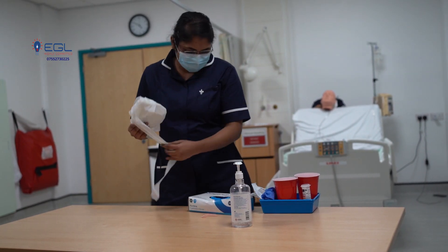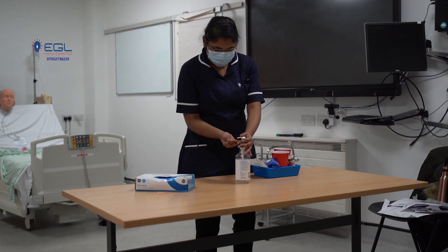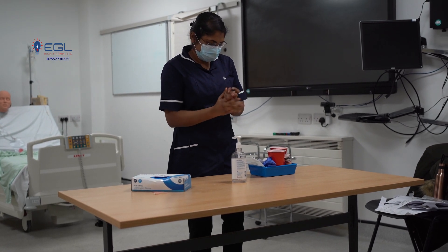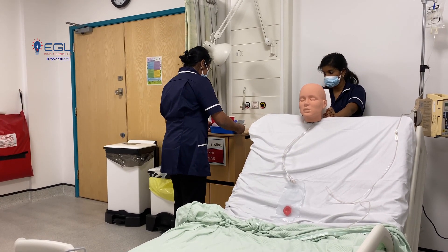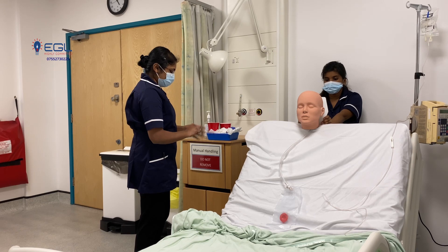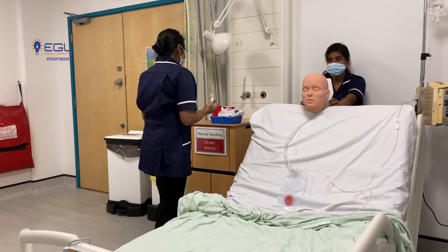I gel my hands according to WHO guidelines. I am back. I am going to explain the procedure. Are you comfortable in this position? Yes. First, I will take the measurement of the tube, and after that I will advance the tube. Is that okay? I am going to gel my hands.